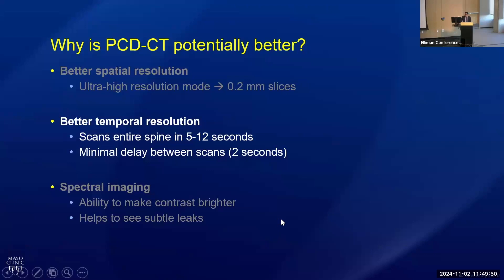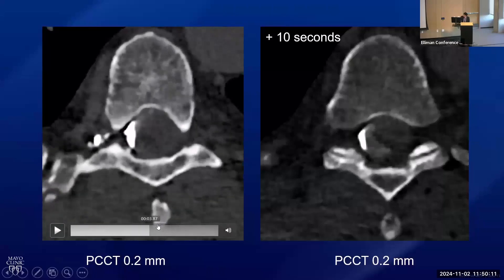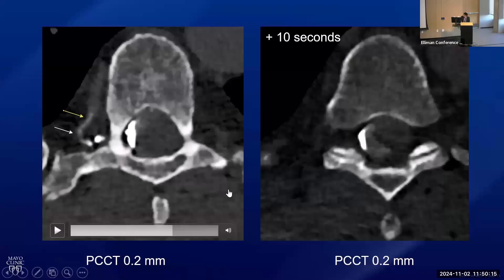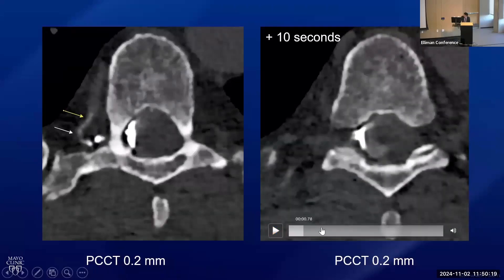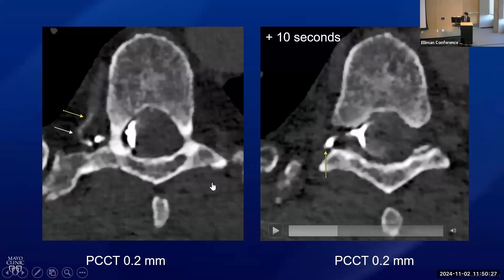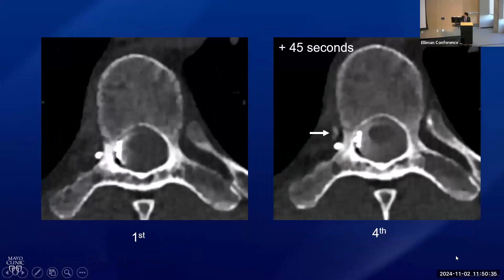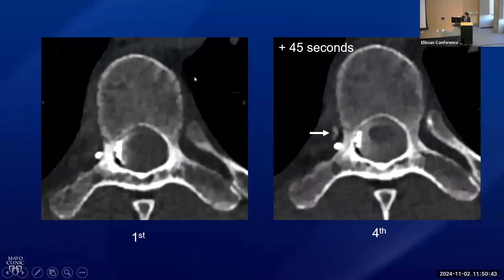Another advantage of photon counting CT is slightly better temporal resolution — you can scan the spine very quickly and perform scans back-to-back for dynamic CT myelograms. This is a patient who had a CSF venous fistula I could see on this initial scan — it's this vein here. I scanned that patient on a dynamic exam just about 10 seconds later, and you could no longer see the fistula. Given the first image, you could probably make out where the fistula is coming from, but if I didn't have both of these scans I probably wouldn't have called it on the second image alone. Sometimes that high temporal resolution really does help. Conversely, sometimes you see the fistula better on the later scan — here's one where I didn't see anything on the first scan, but on another scan 45 seconds later there's a very subtle CSF venous fistula going into the paraspinal vein.